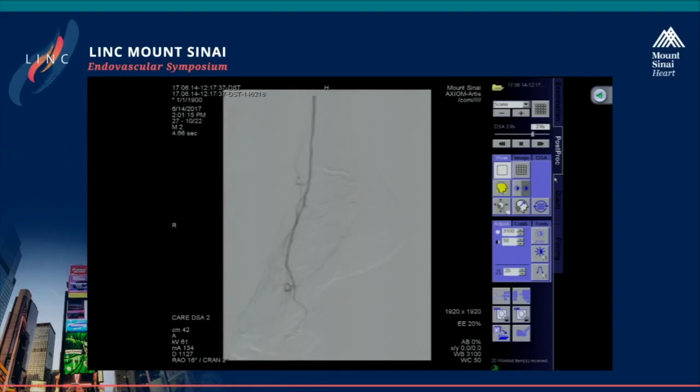I mean, I think at this stage, it's just for the live case, we wanted to demonstrate this. We will 100% now with that kind of flow. We can take a picture further up top and then see if there's an ostium of the posterior tibial and go after it. Or if we need to come through the plantar loop, we can do that as well with an antegrade stick. But that's a very important suggestion for a global revascularization.